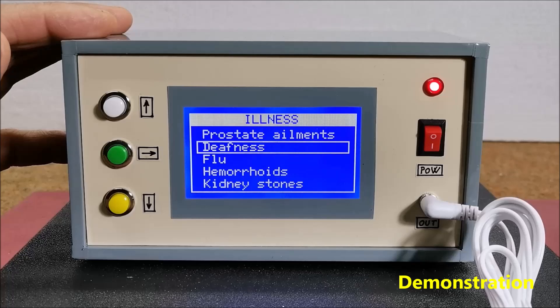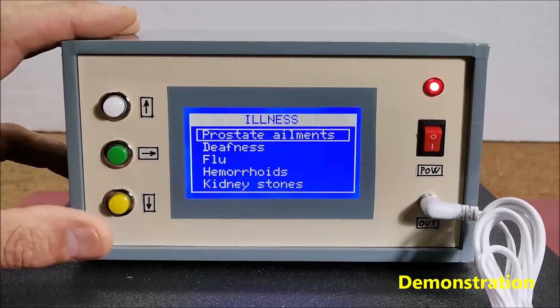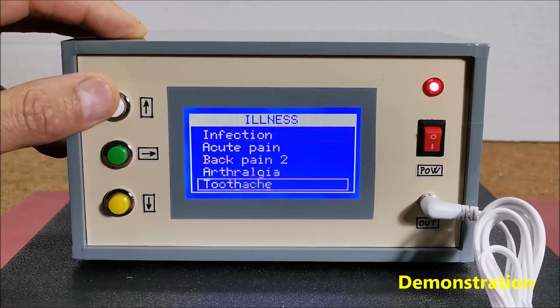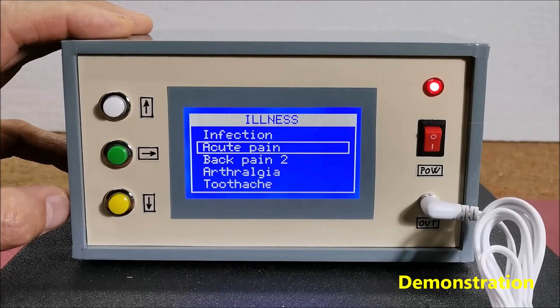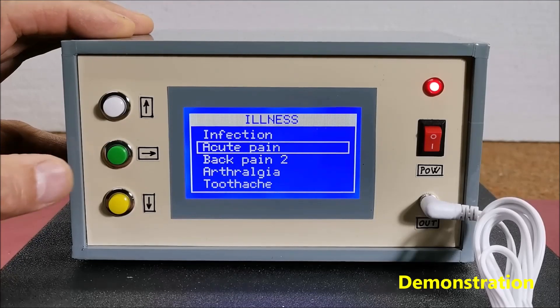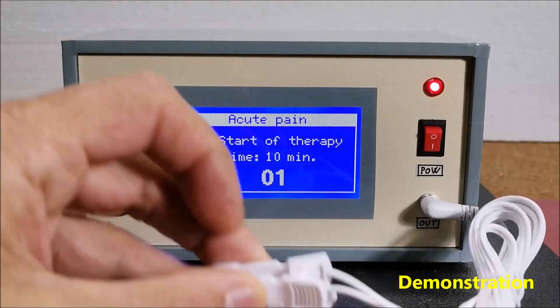The set of frequencies for each disease can be downloaded for free online if you search for a Rife frequency list. Now that we have selected the therapy for a certain disease, we press the start button and the duration of the whole therapy and the elapsed time from its beginning appears on the screen. The voltage from the generator can be applied to the patient in both hands by means of two electrodes connected to these clips.